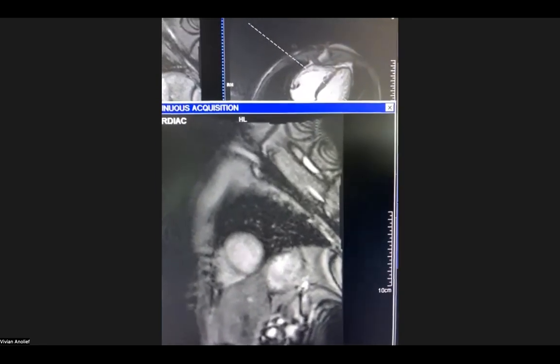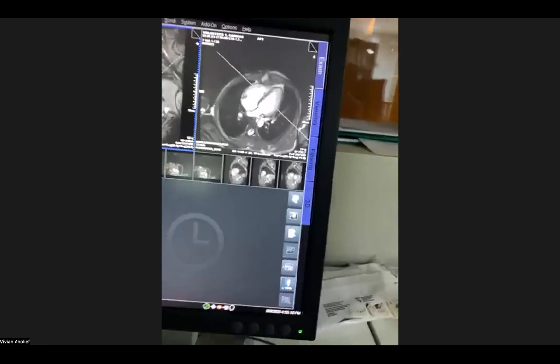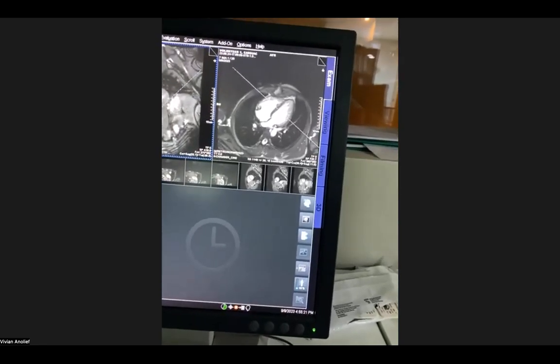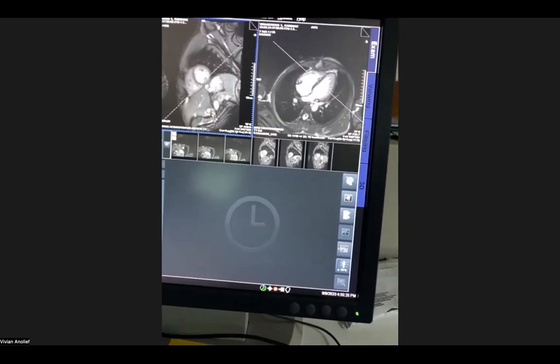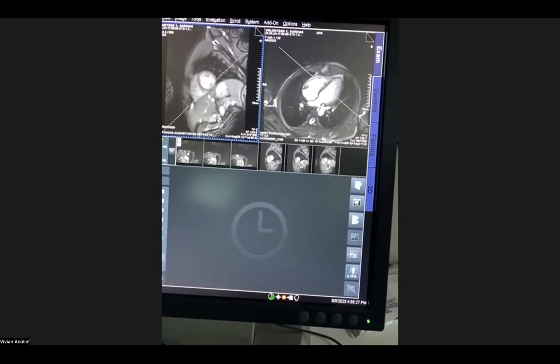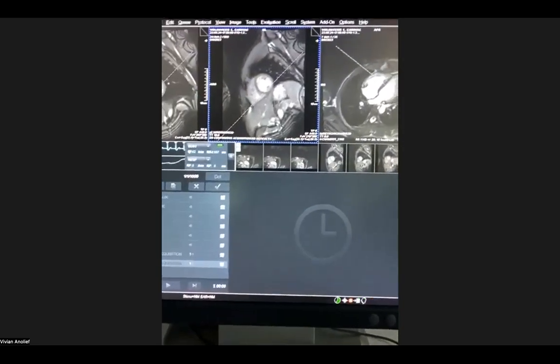Stop. Yeah. So now we stop the acquisition, and that is the exam. To do the analysis, we look at the signal intensity during the breath hold, but I think we'll be showing you that another time. So I don't know, I can take any questions if anyone has any. I hope that was clear.